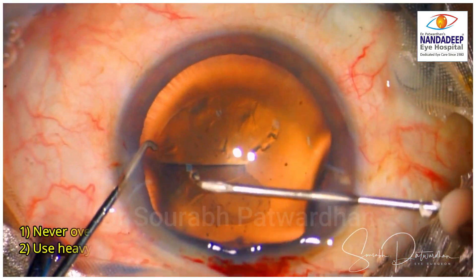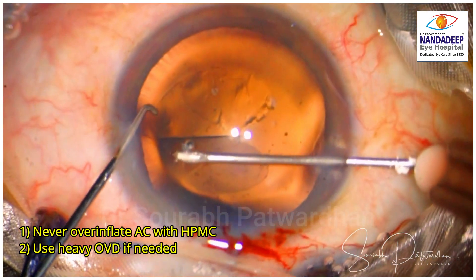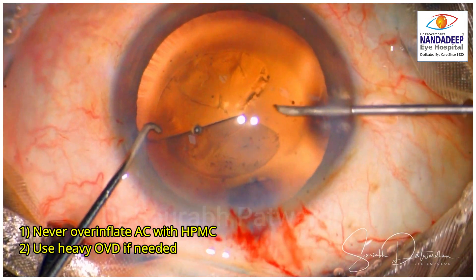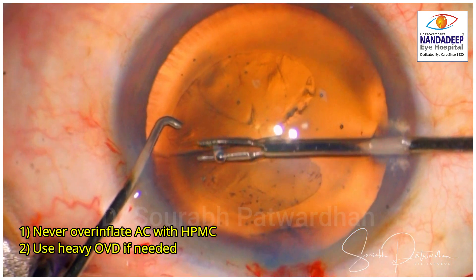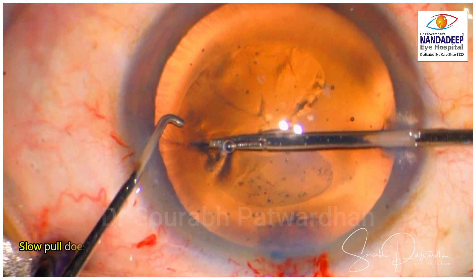The trainee realizes that and tries to put some OVD. Now at this point, it is important not to over-inflate the anterior chamber with HPMC. If required, use some heavy OVD but avoid over-inflation. I have shown this in previous videos. Now the trainee shifts to micro capsulorhexis for safety, which is a good move.